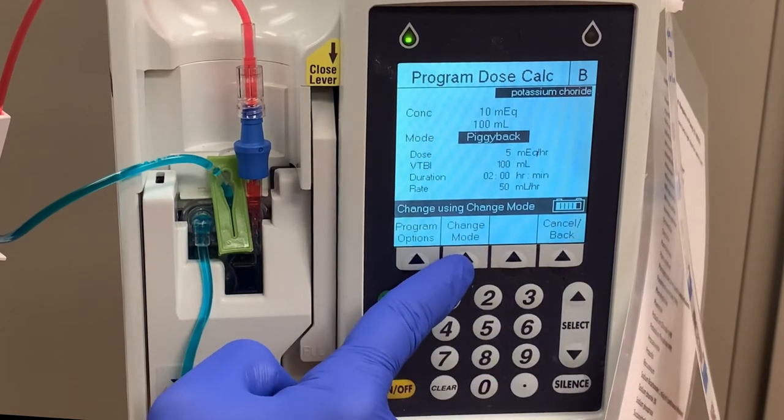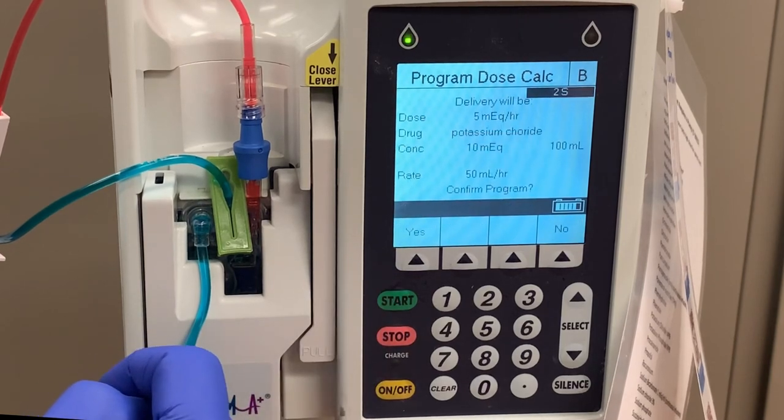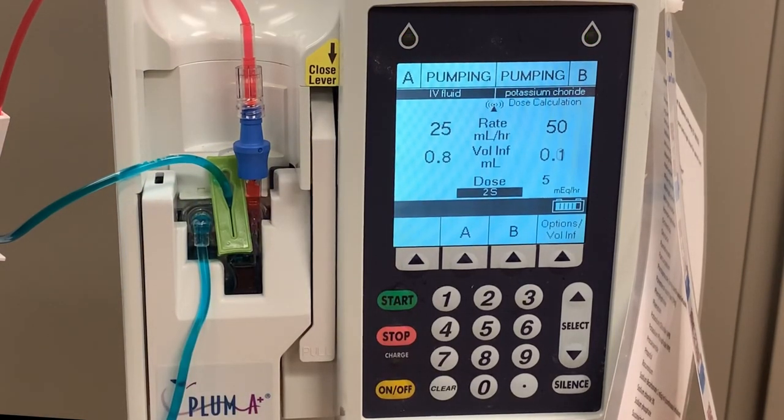Highlight the mode and press the change mode key. You've changed piggyback to concurrent. Now when you press start, the B line will run at the same time as the A line. Nothing will be delayed. Unlike in piggyback mode, with concurrent mode, when the B line runs empty, you will get an alarm to alert you that you need a new bag.